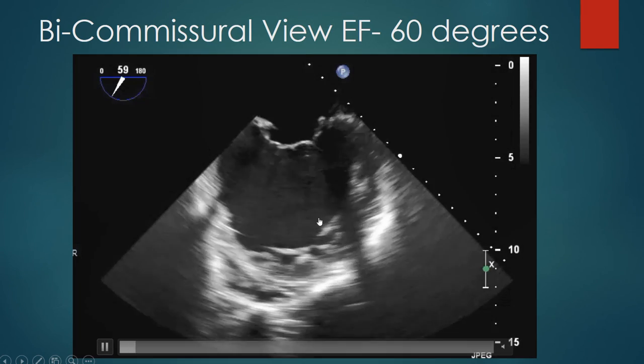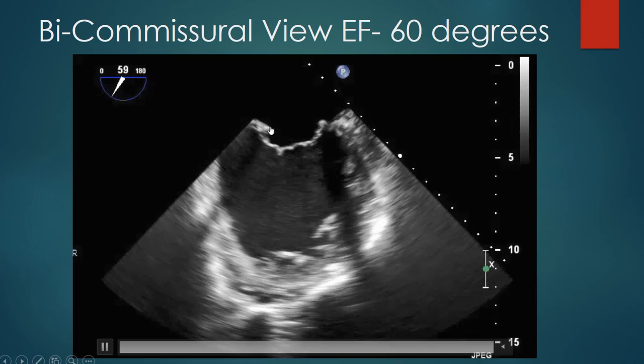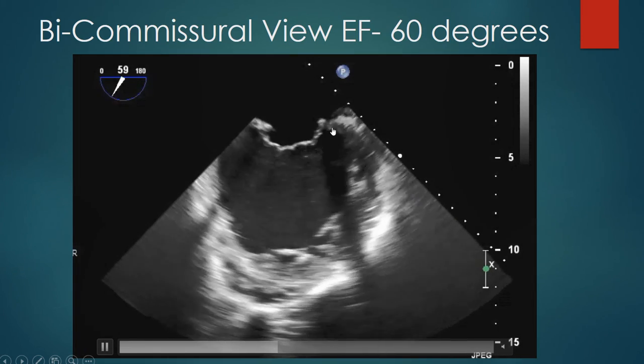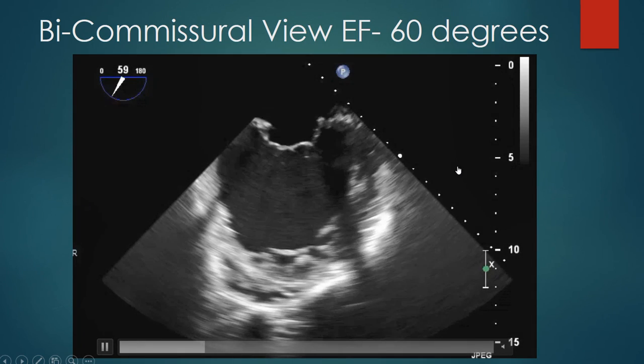You can see that this is a dilated cardiomyopathy, global hypokinesis with a dilated annulus, a prior mitral valve ring repair, and this is an evaluation for a MitraClip procedure.